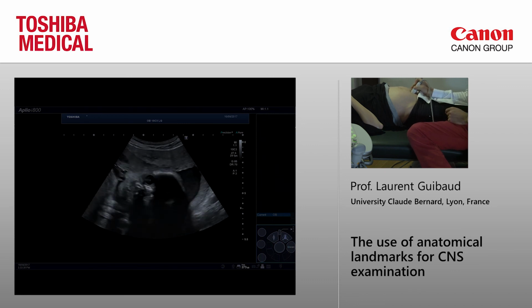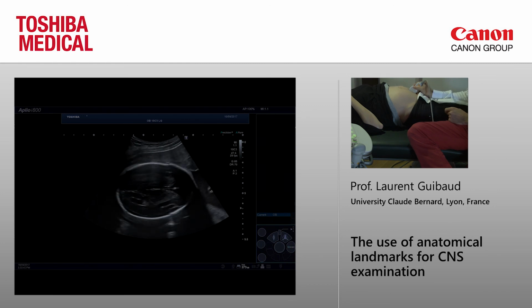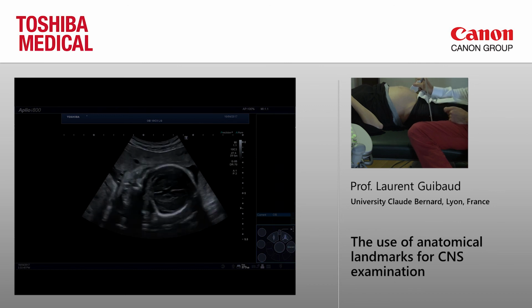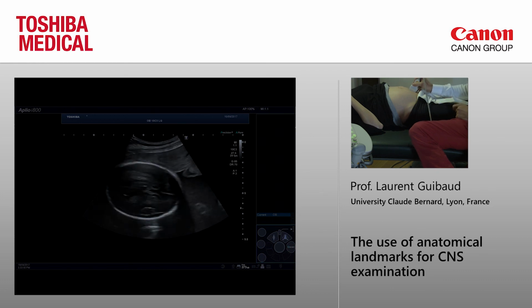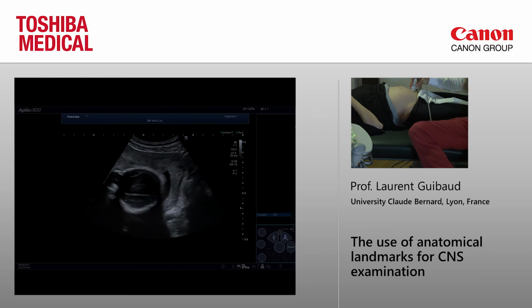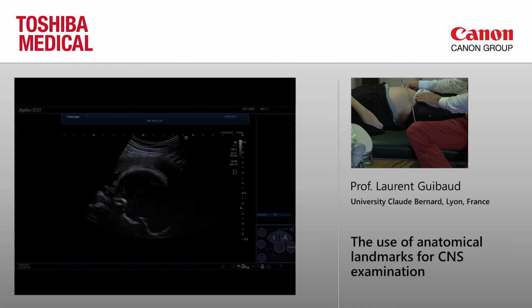Okay. So you see on my hand, this is axial. I just have to turn like this for coronal, and there are two, in fact, walls of the house. One here, one here. And if you want to put the roof, it is here. The roof should be here.